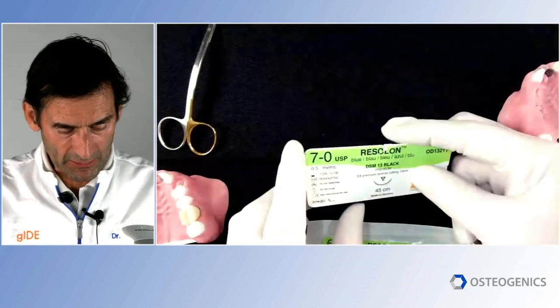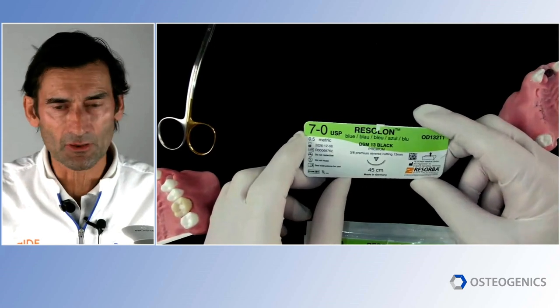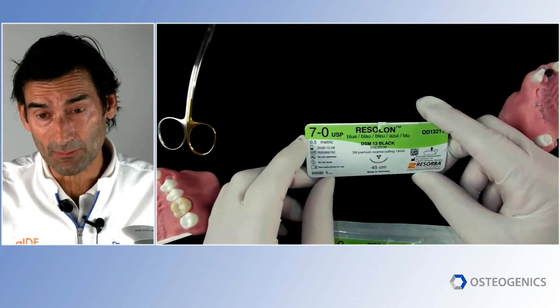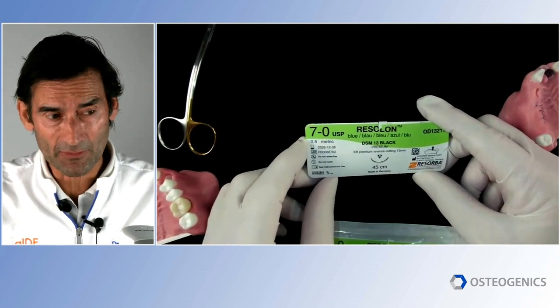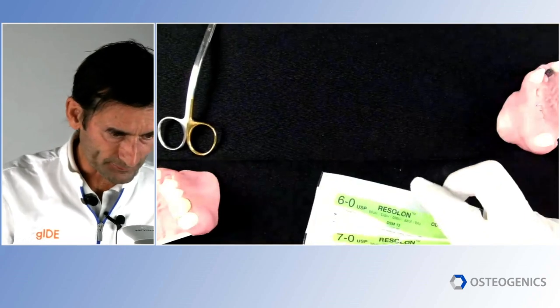And then just showing you here, this is a really unique suture because it's a 7-0 suture. And these, of course, are very useful when you have very thin tissue, you're doing mucogingival surgery, maybe you're doing a tunneling procedure, you have a small soft tissue graft. So these are really unique. And these are all nylon.